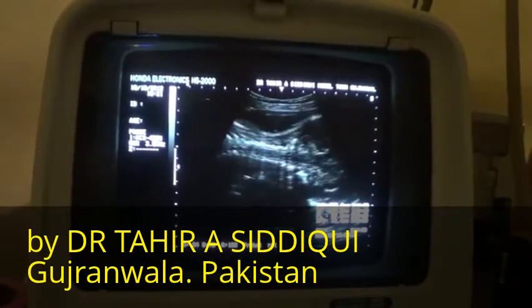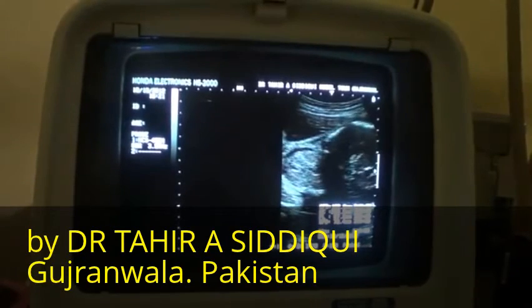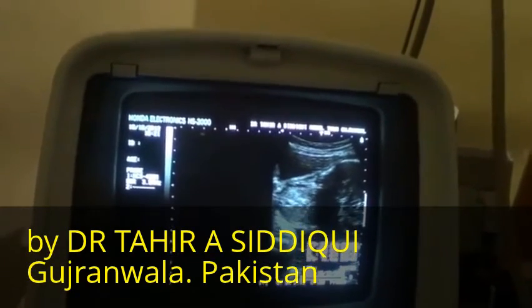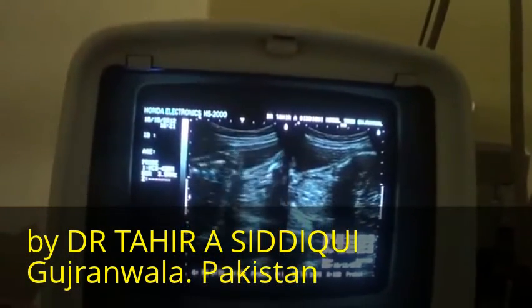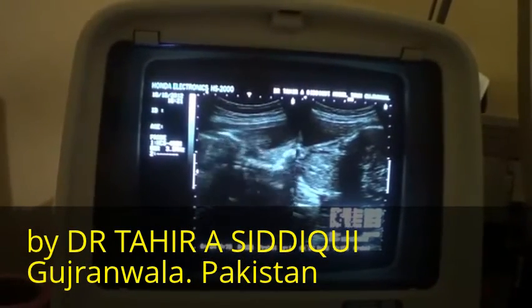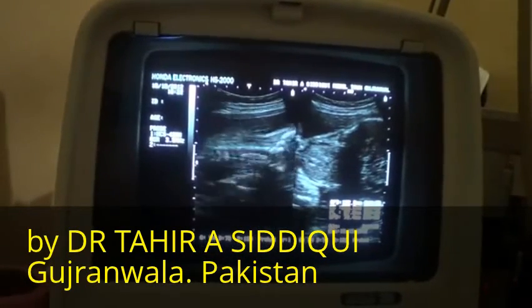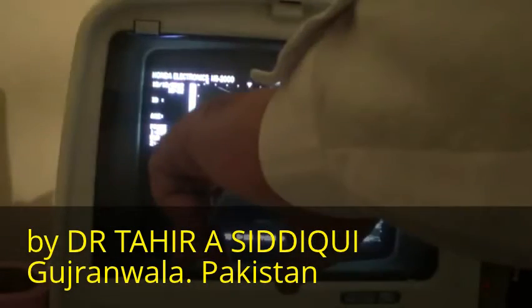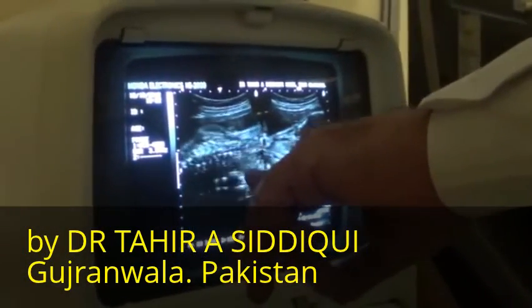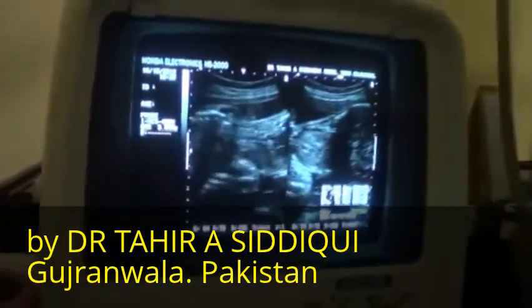So there is a mass. Now I will show you with this curve. And here I will show you with it relating to the chest, trachea. This is the neck region. This is the posterior portion of the neck, posterior neck region. And this is the anterior neck region with two lobes. You can identify two lobes. Okay, we will study it later.